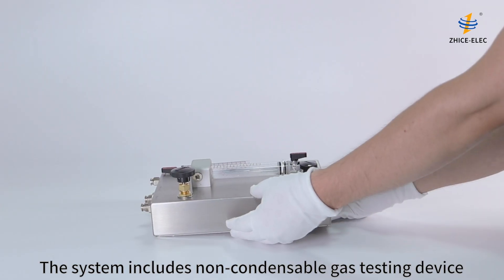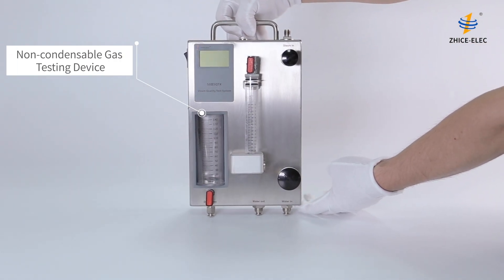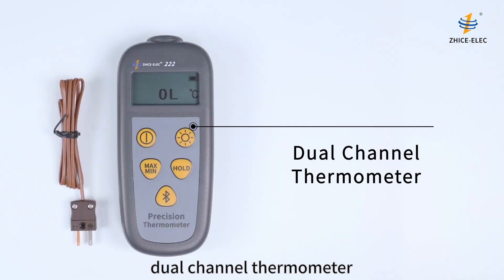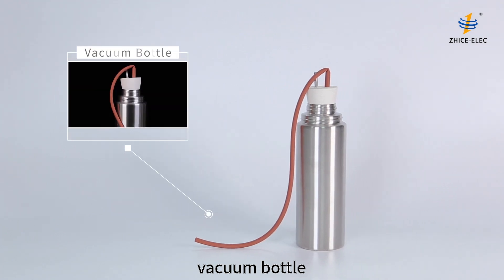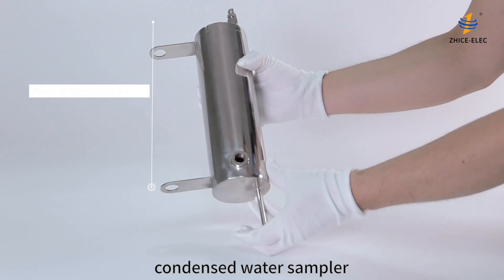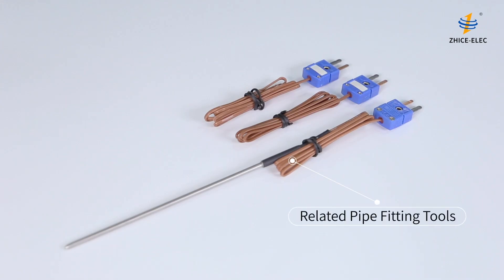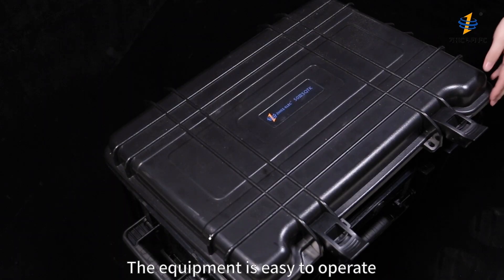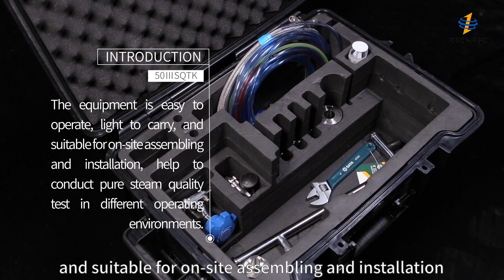The system includes a non-condensable gas testing device, dual-channel thermometer, electronic balance, vacuum bottle, pitot tube, condensed water sampler, and related pipe fitting tools. The equipment is easy to operate, light to carry, and suitable for on-site assembly and installation.